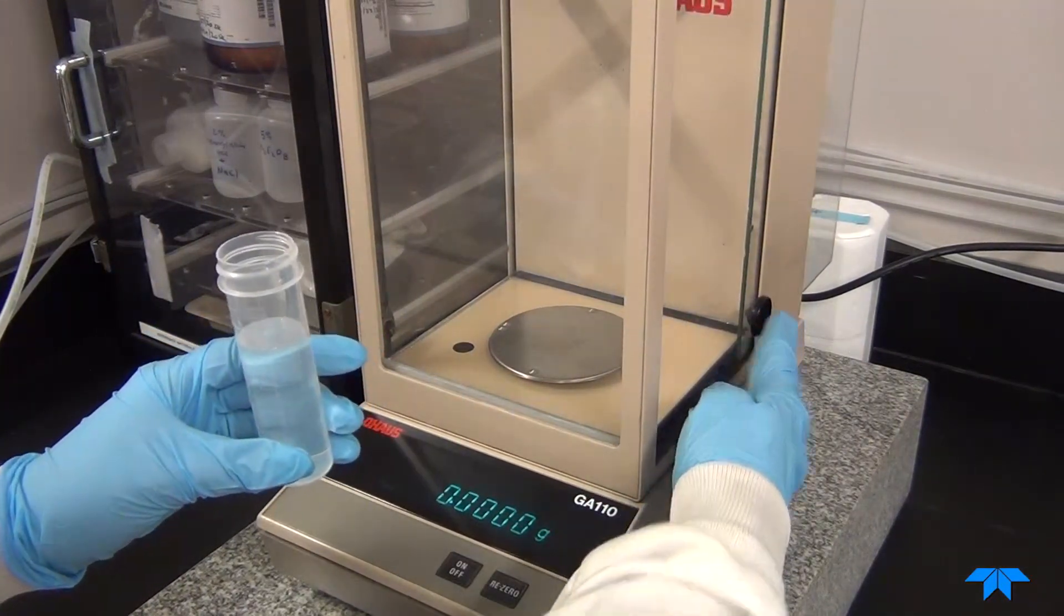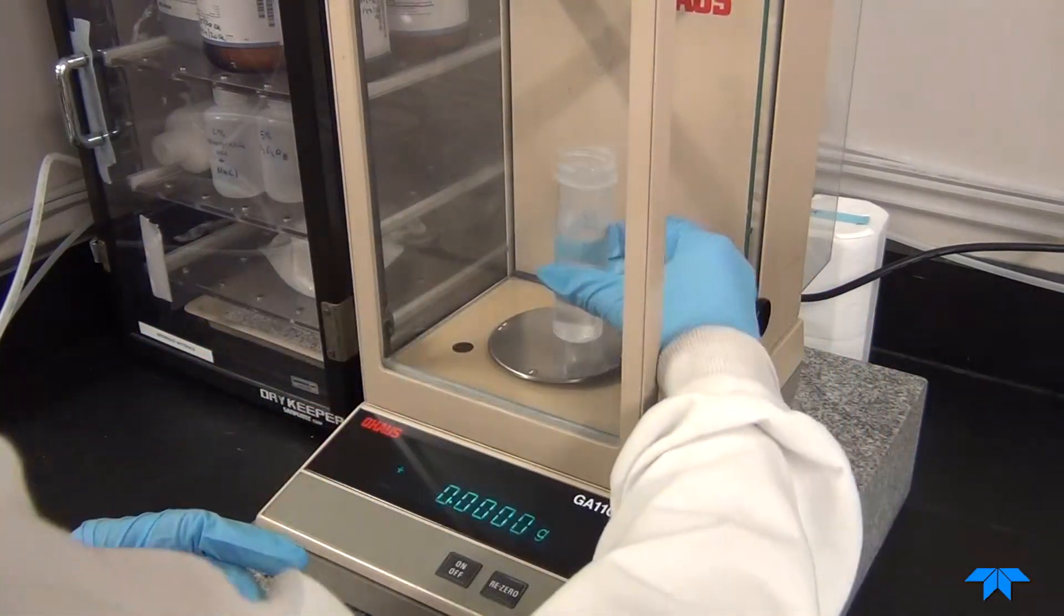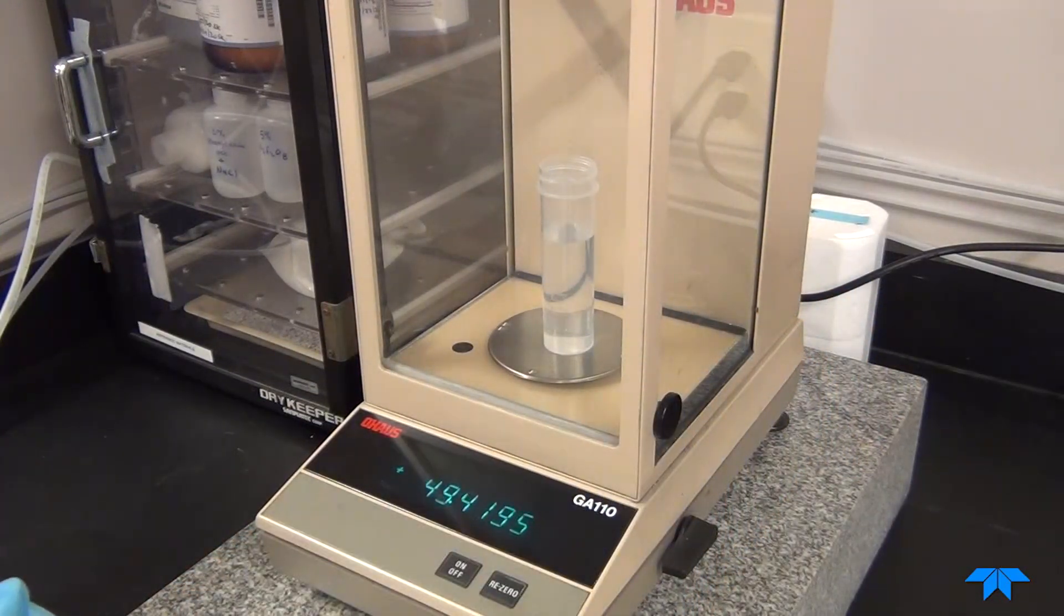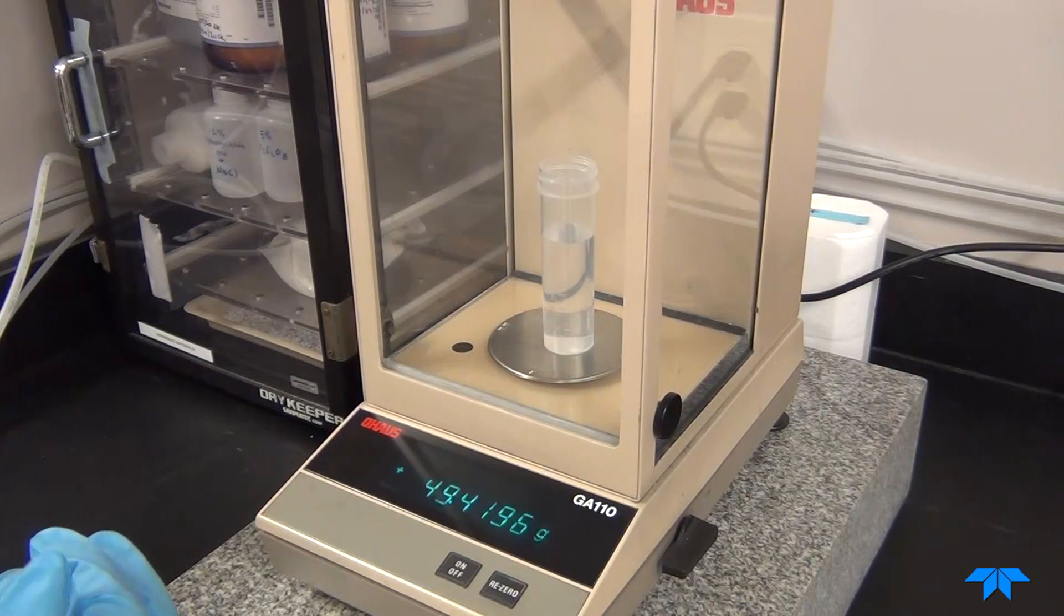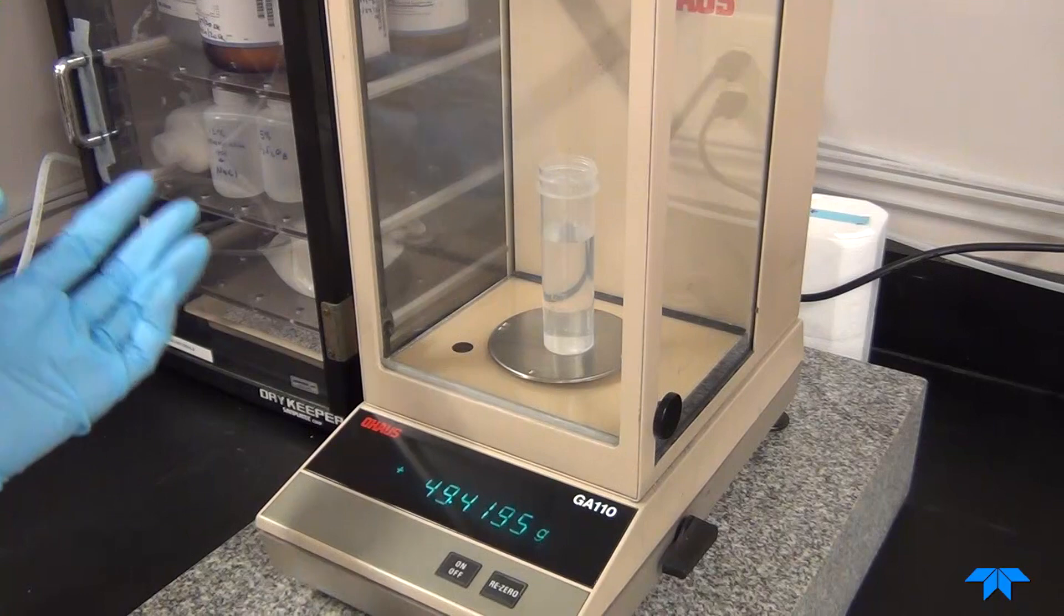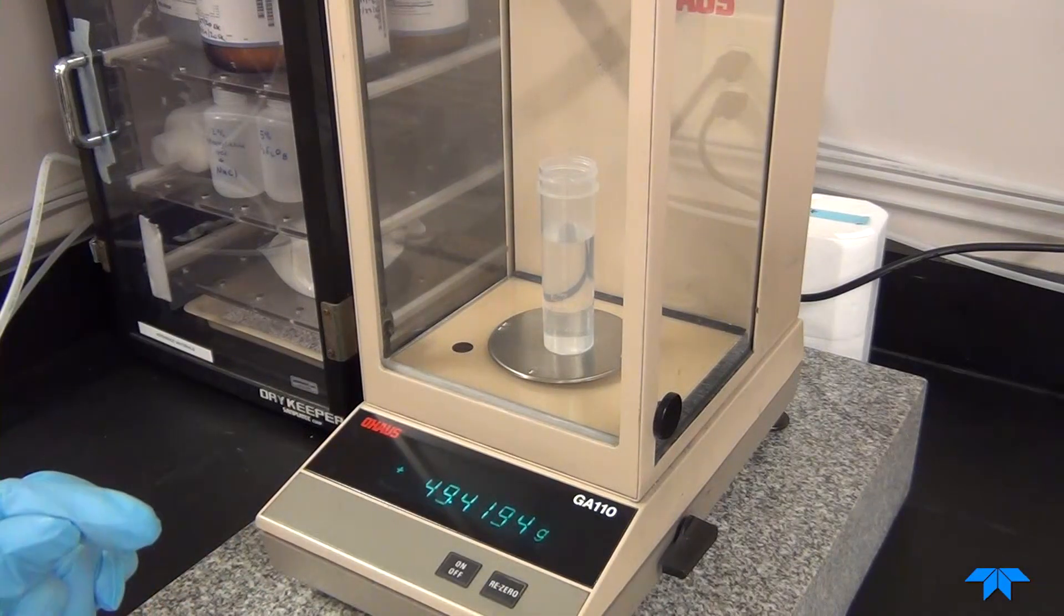Tare the balance, then place the container on the balance, allow it to stabilize, and record the weight of the container. This is the after weight. In our case, it's 49.42 grams.